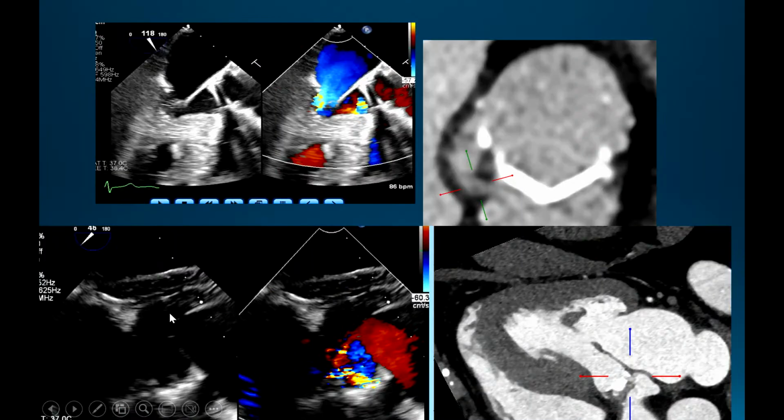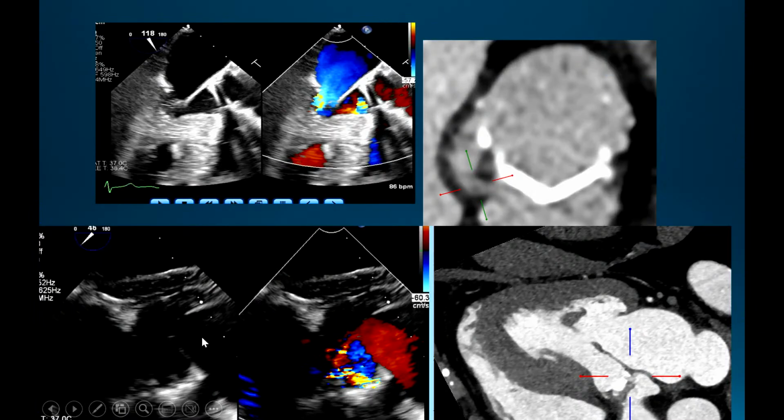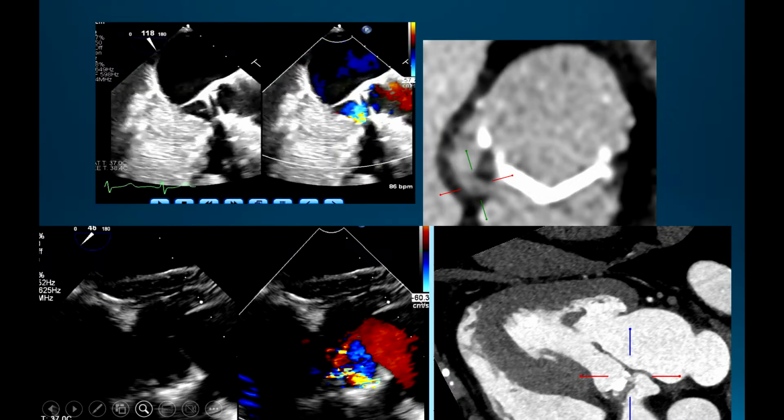So you have to be able to find it. So for instance, this patient has a very good, sorry, let me get back. All right, I can make this play. There was a jet here. This is a gastric view. I'm sorry.